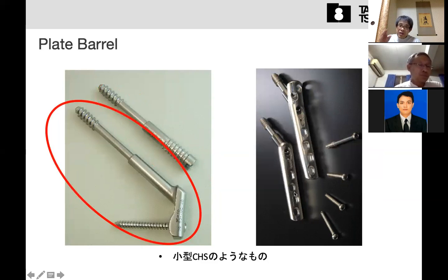So if we make an improper angulation of the screw, then the plate comes like this. It cannot be adjusted because the bone here is intact and very hard. So to avoid this, I made some curve here to adjust for angulation error when inserting this screw.